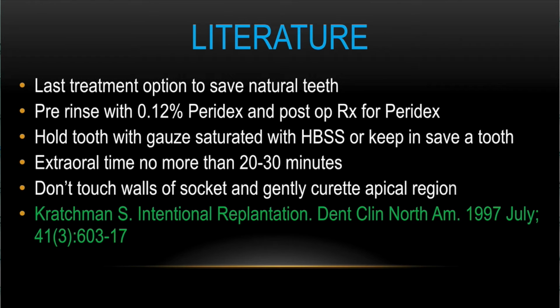And every case we treat the same. We go through the pre-rinse with the Peridex. We have the post-op prescription for the Peridex. We're just trying to eliminate any bacteria that could be hindering the healing process. During the whole process, we're holding the tooth with the gauze that's saturated in the Hank's balanced salt solution, that Save-A-Tooth kit. And when we're not working on them, we keep it in that Save-A-Tooth kit.